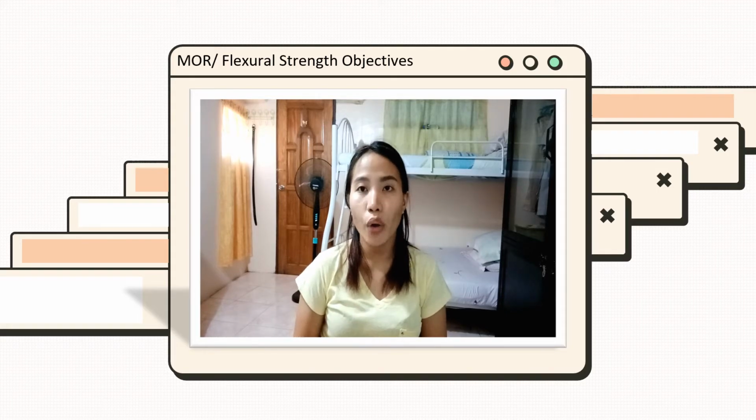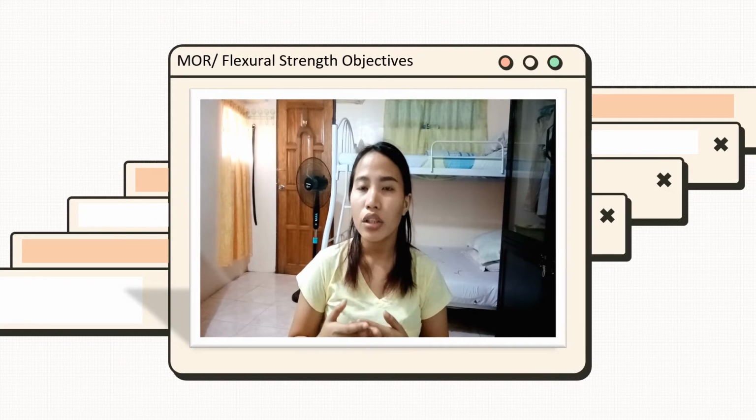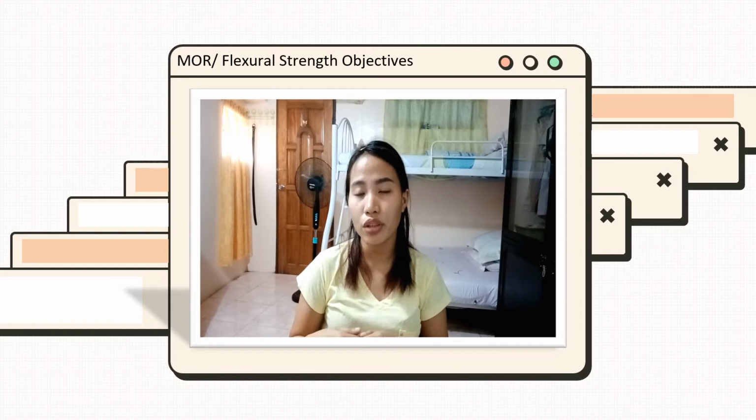So today I am going to show you the concept behind the MOR test. But since we are in the middle of a global health crisis, we are in lockdown, and so we are back at our respective homes. So definitely our resources are limited. But as students of MSU IIT, we should always be flexible and innovative at times like this. As a result, I am going to utilize materials which can be a good representation for the MOR test.